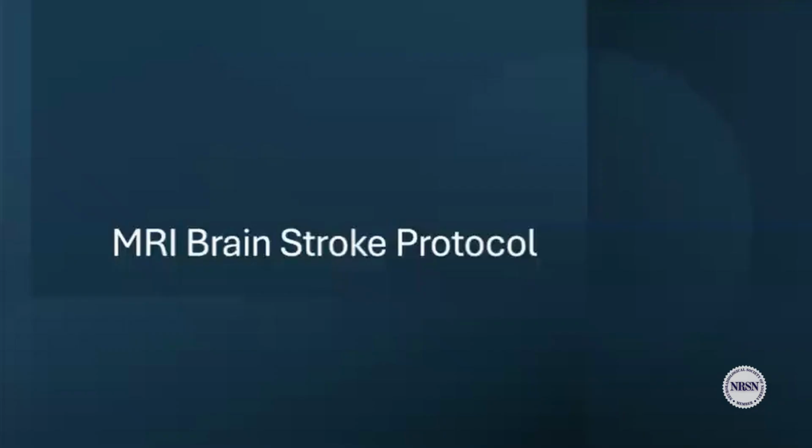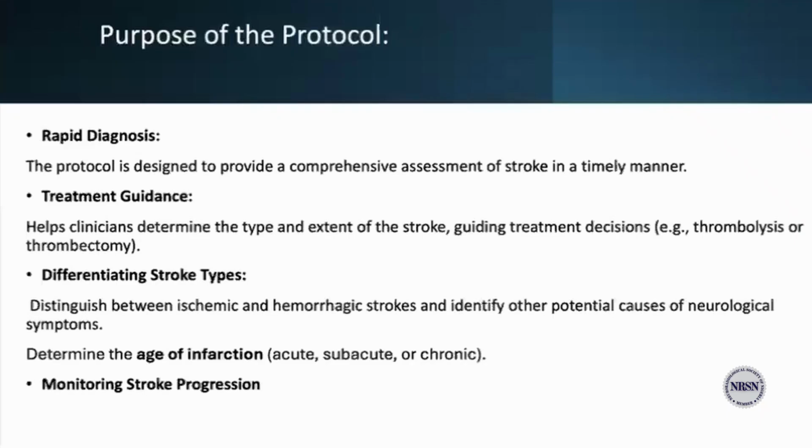And now that we have looked at the key sequences we use for brain, we'll just go straight and look at a few protocols that we use for MR brain scanning.